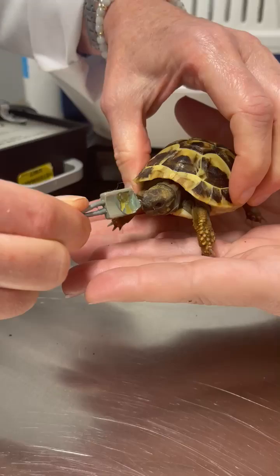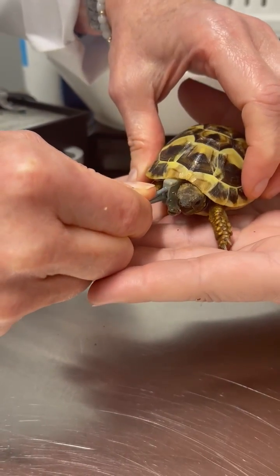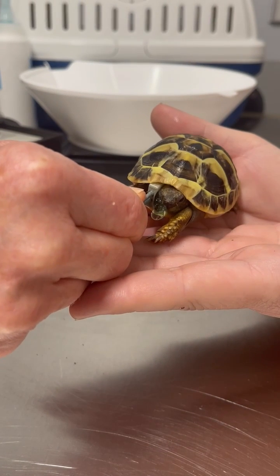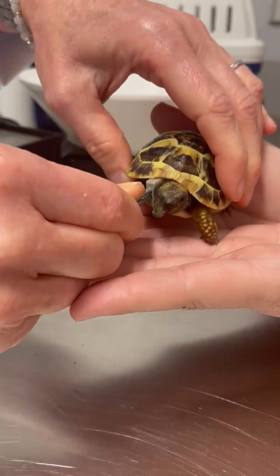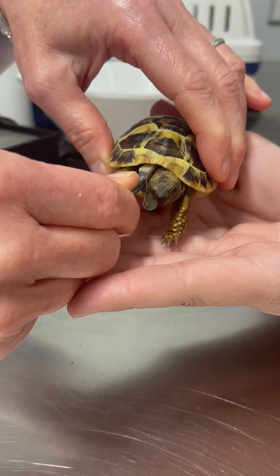It's going to be a little cold. I'm going to put it right up here. He's like, that's weird. So that's the heart beating.